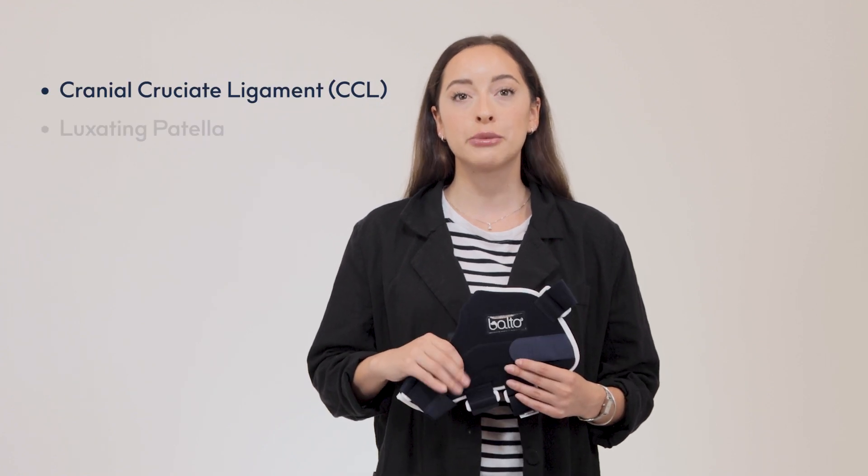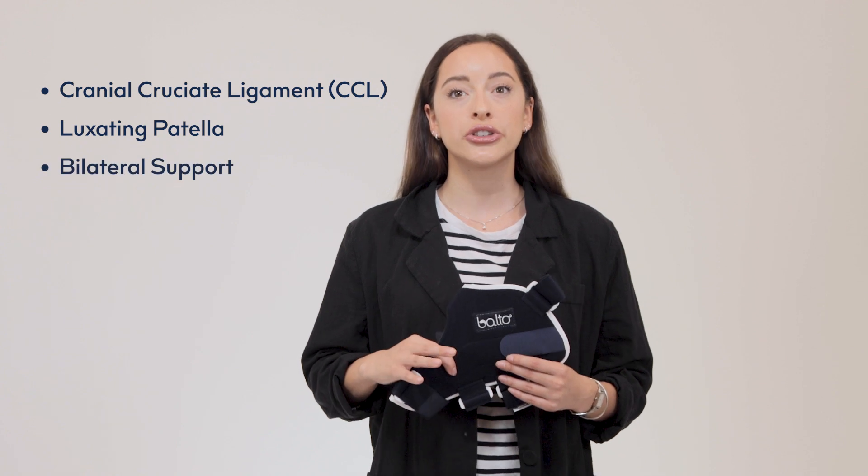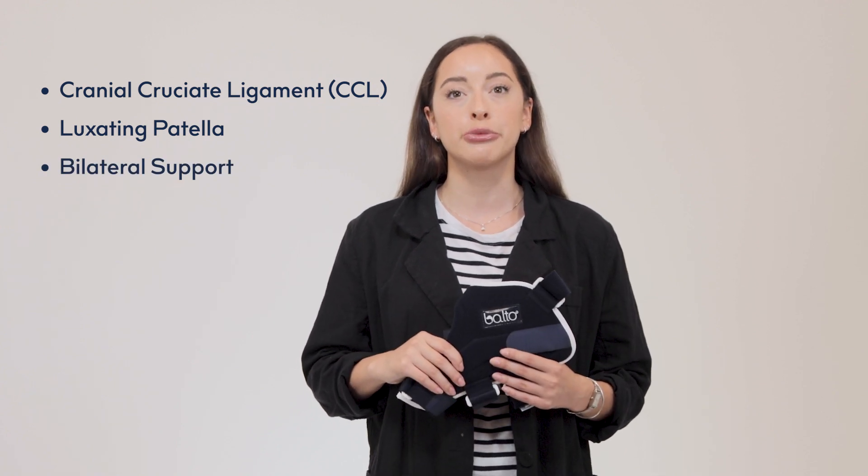This brace can be used to support common knee injuries such as cranial cruciate ligament injuries or a luxating patella. This brace can also be used bilaterally in cases of injury to both knees for contralateral support. Contralateral support is so important to consider when your pet has an injury on one side, to help ensure that the overcompensation for the injury doesn't injure them any further.